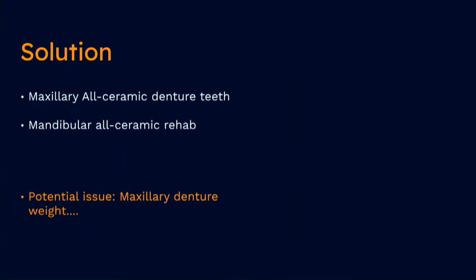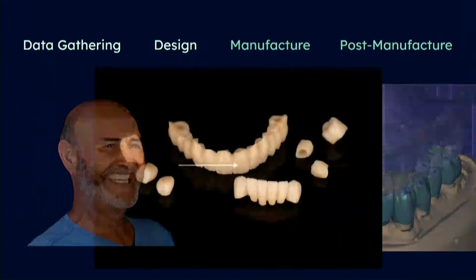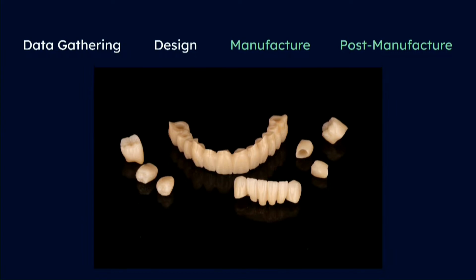And that is to design and create custom-made denture teeth fully out of monolithic zirconia. So I went back to the digital world after scanning the patient's most recent models of the maxilla and the mandible and designed his definitive restorations to resemble the mutually accepted provisionals. In doing so, I have created the patient's mandibular crowns and bridge and made a splinted set of monolithic zirconia teeth to be incorporated to his record base for the maxilla.